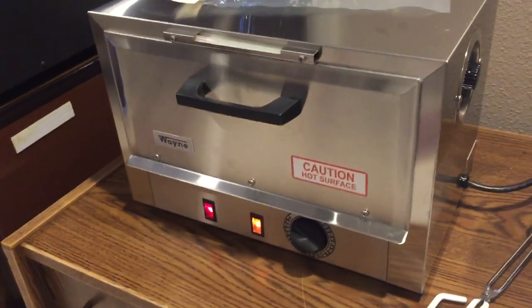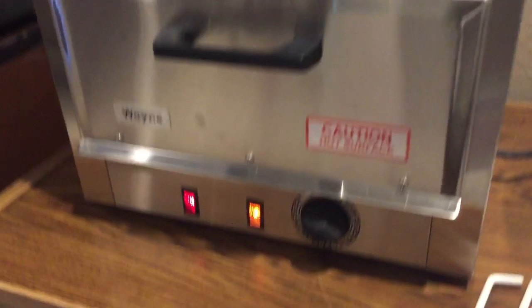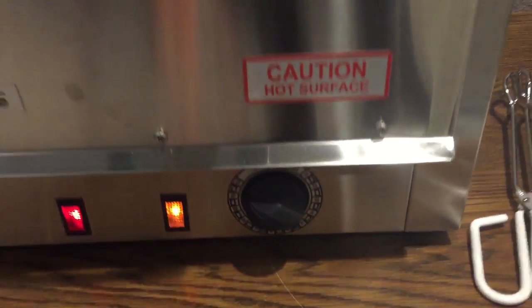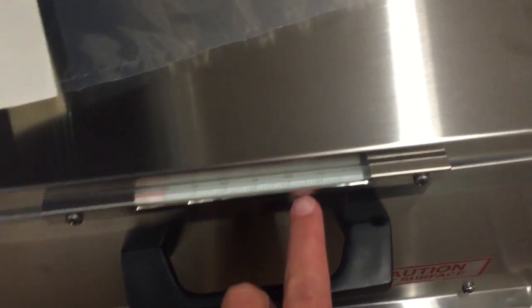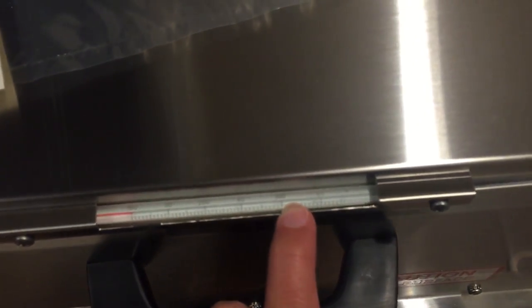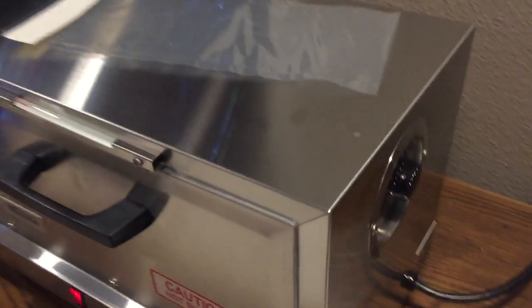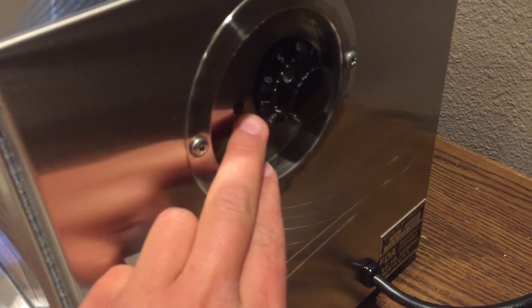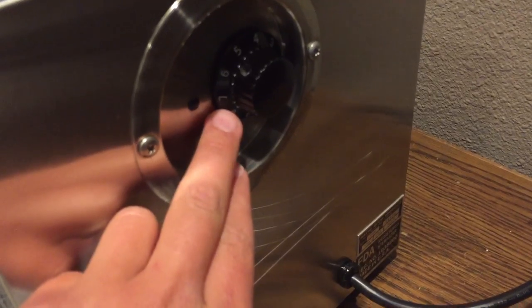In order to sterilize properly, it will need to be at least 120 minutes, which is the max right here, and the temperature has to stay at least 320 degrees Fahrenheit. In order for the temperature to stay, it will need to be next to the black dot, the number seven.